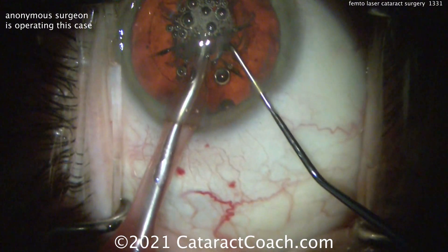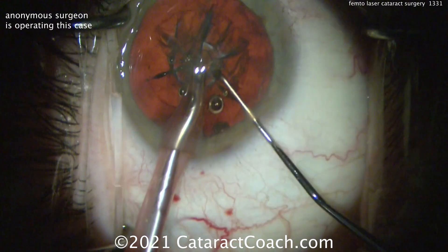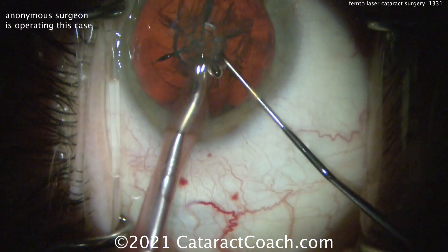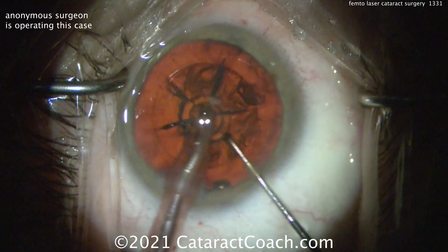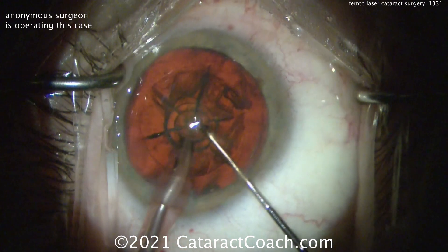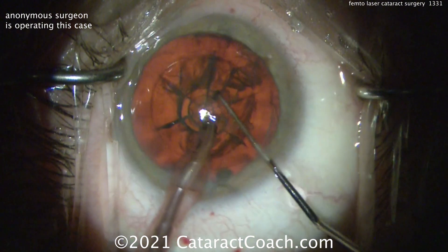So now putting the phaco probe inside the eye. It looks like a left-handed surgeon — phaco probe in the left hand and the chopper or second instrument in the right. And you can see those are the six quadrants that are made. Let's see if we can just pull out one — using that little vacuum in the center, taking out that center part.